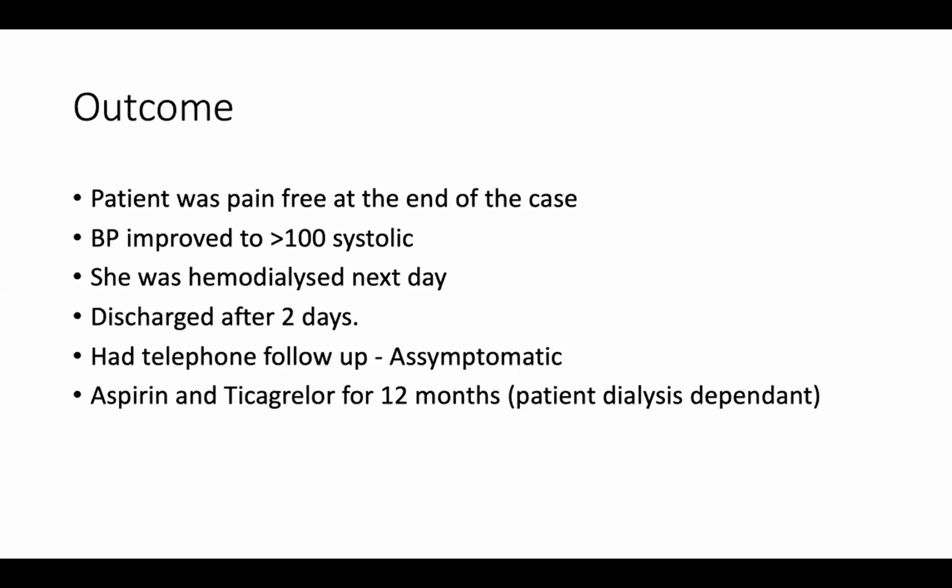So in my hands, this was either a smash and grab PCI or an Impella guided PCI. But the important thing here to note is that every time I backed out the guide, the blood pressure would recover. So I was quite happy that I'd be able to do this case. And having 2 wires down allows you to back out your guide, and means that you can do the case with reasonable blood pressure.